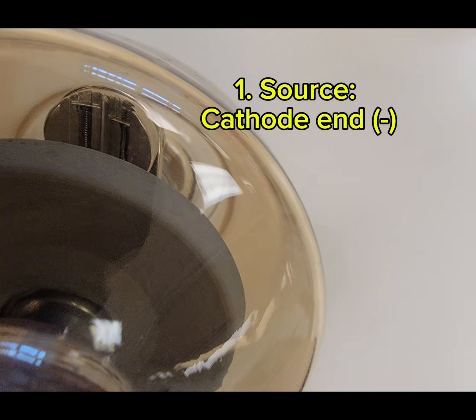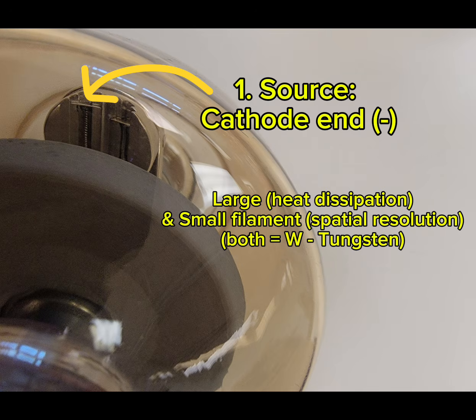So step 1, source. I've zoomed in here on our cathode, and you can see that we have both a large filament and a small filament. Remember that the large filament is better at heat dissipation, should be used for tube warm-up and large techniques, and the small filament is going to be better at spatial resolution.